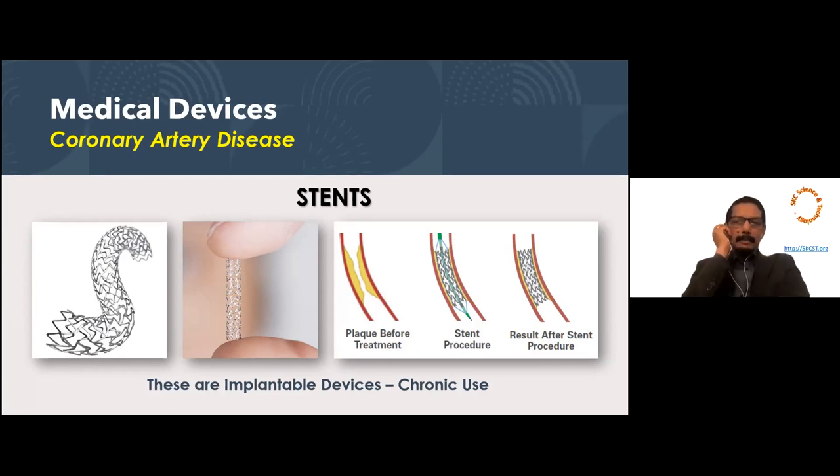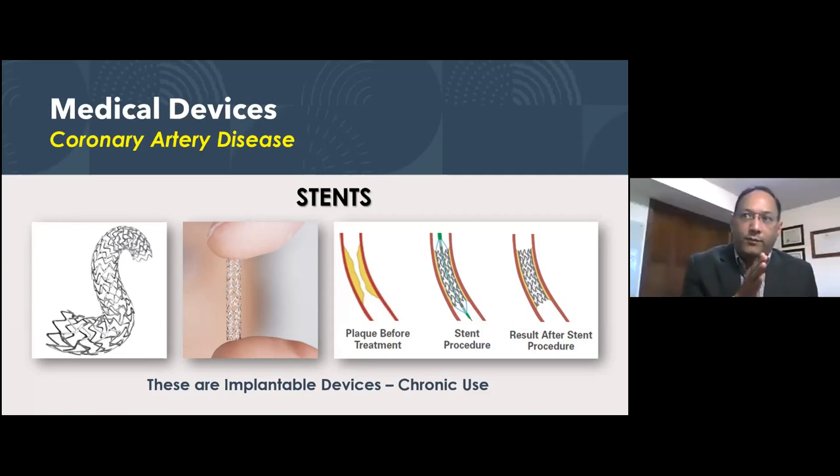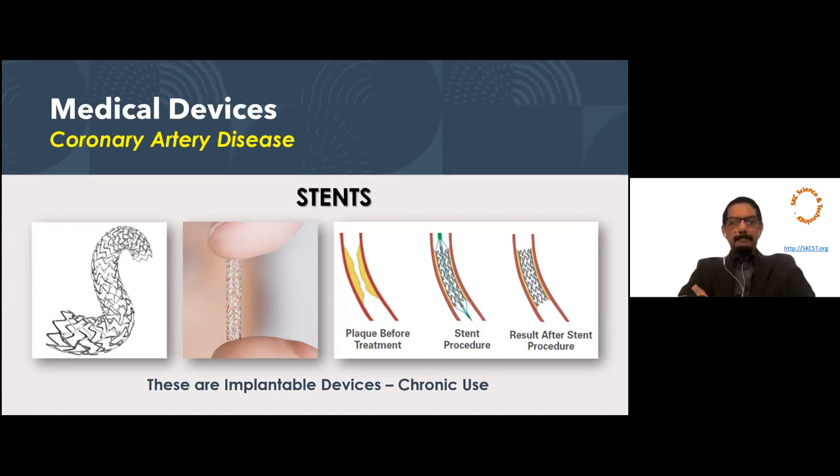So let me ask you a slightly interesting question. At least to me, it is interesting: from the initial design of these stents through your clinical trial to make sure it is correct, what's the length of time it takes to go from initial design to that stage, typically? Short answer is 4 to 5 years, but it depends, and I will show you the timeline. I have the precise answer in one of the slides coming. Okay, great, thank you.